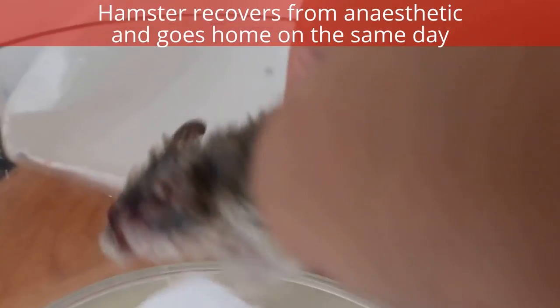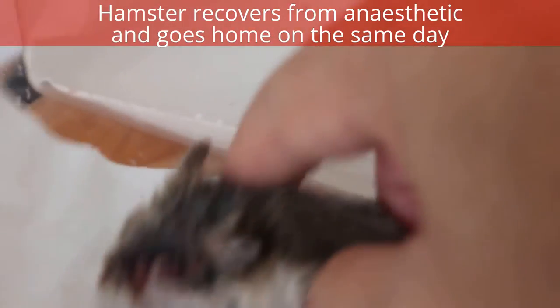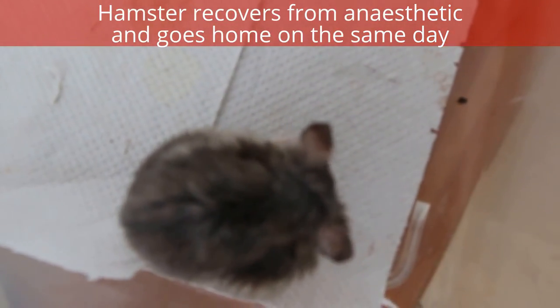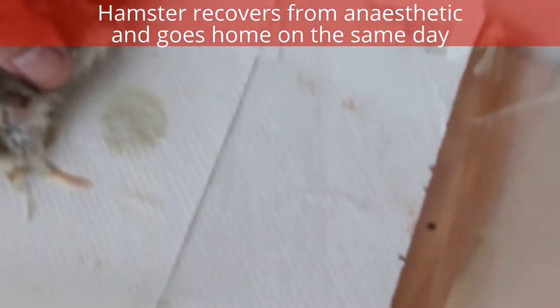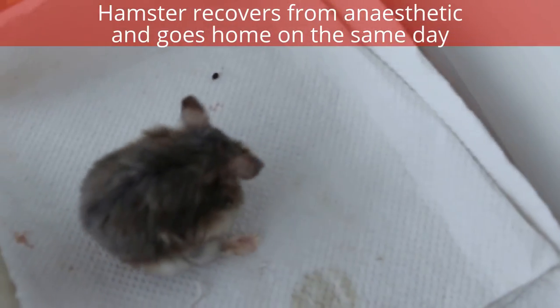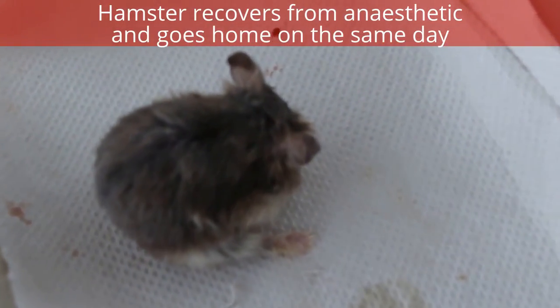And you can see his eye, four stitches actually, but it's not obvious here because of the color of the stitch here. So I will let him go back here and rest. And he's still got one good eye and should be able to live until the end of his lifespan or so. No more sand bath for this hamster, much loved by the family because apparently he's quite a nice chap. He doesn't bite or try to escape according to the owner. Very rare because hamsters like to escape, yeah.